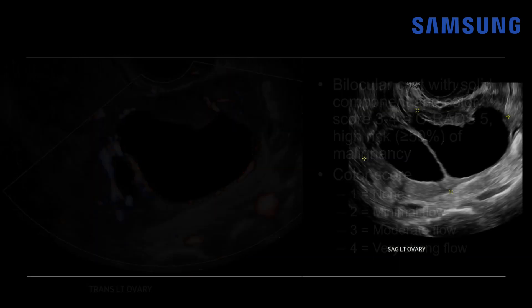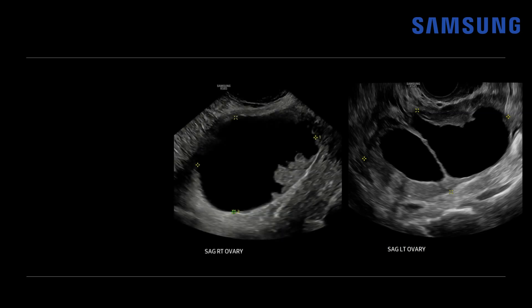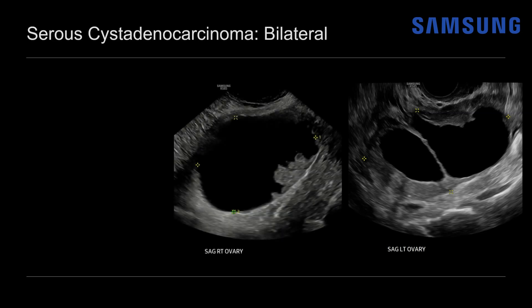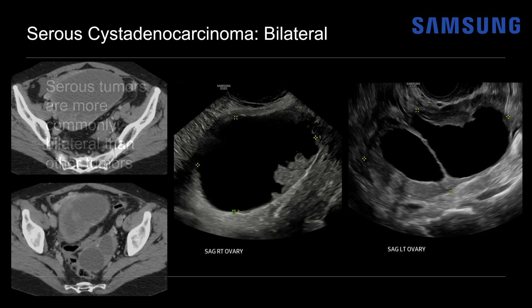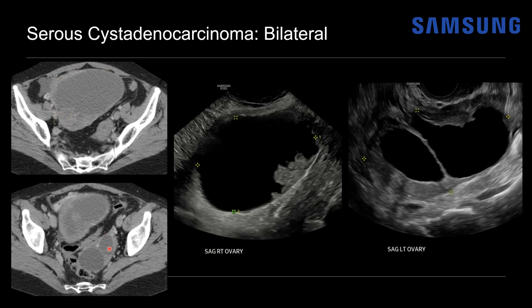This left ovarian mass was actually from the same patient who had the right ovarian mass, highlighting that serous cystadenocarcinoma can be bilateral. Serous tumors, whether benign or malignant, are more commonly bilateral than other ovarian tumor types. The CT scan confirmed the large right mass with the papillary projection and the smaller left mass that is bilocular with irregular septal thickening.